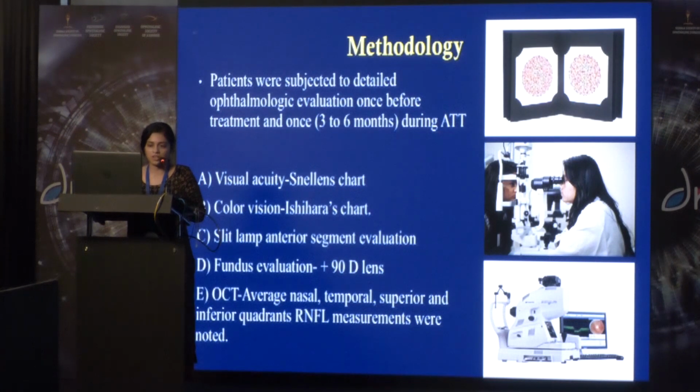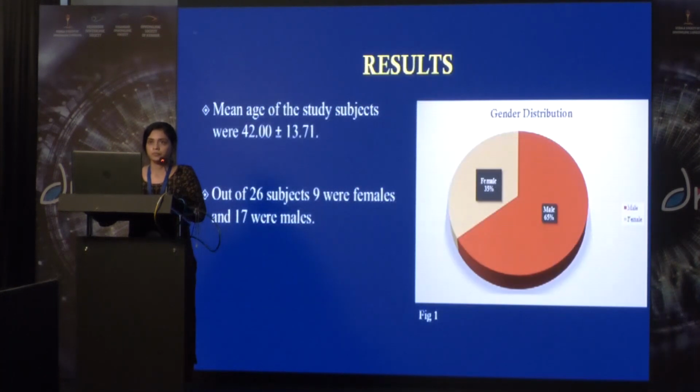Color vision using Ishihara's chart. Slit lamp anterior segment evaluation and fundus evaluation using 90D lens. OCT average nasal, temporal, superior and inferior RNFL measurements were noted.